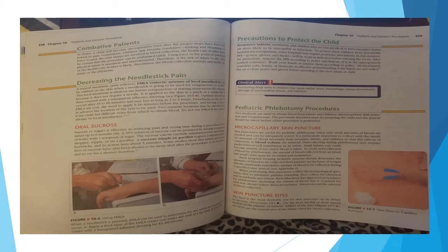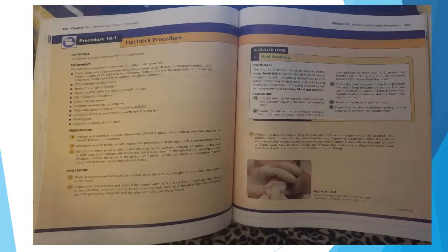Skin puncture sites. The heel is the most desirable site for skin puncture on an infant or neonate. Use the most medial or most lateral section of the plantar or bottom surface of the heel. Do not use the central area of the infant's heel for blood collection. Procedure 10-1, heel stick procedure. Rationale: to perform a blood collection from the infant's heel.